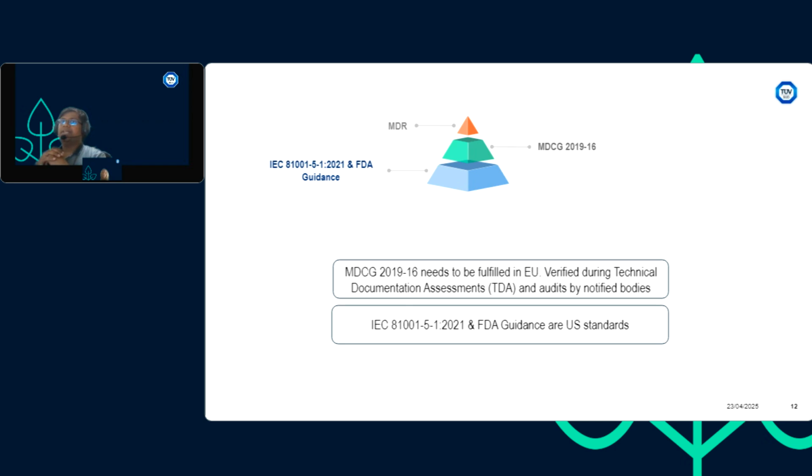One level further, it's IEC 81001-5-1 and FDA guidance. Okay. FDA guidance is obviously the FDA premarket submissions guidance. It's the US primary FDA requirements, and IEC 81001-5-1 again, which I mentioned, and the Europe, which was supposed to harmonize last year, but now it's a little bit postponed due to the restriction. But this standard is still good because FDA has this particular document listed in their recognized database.